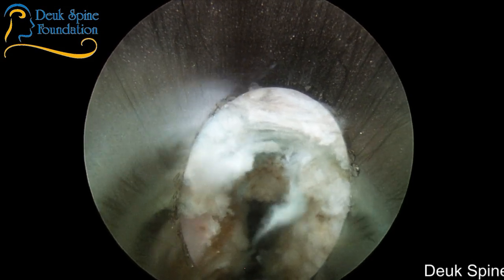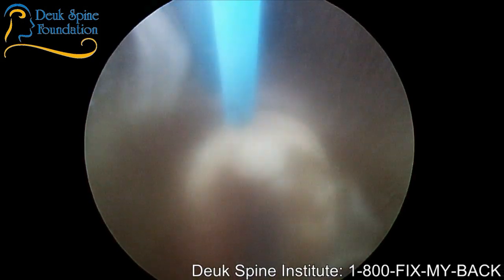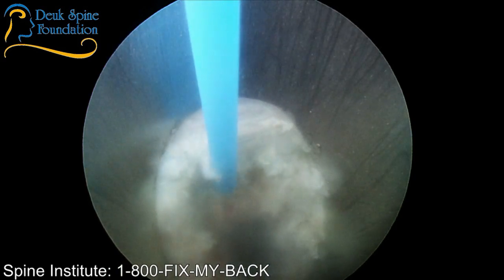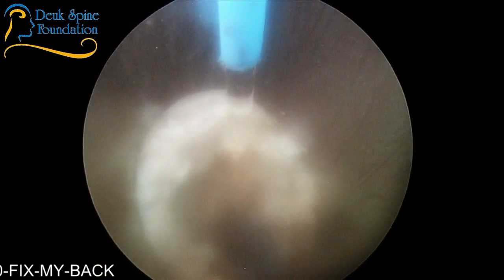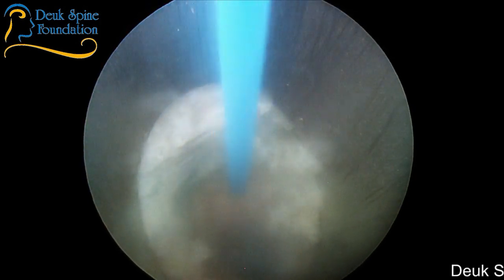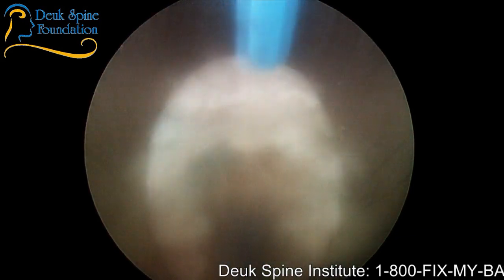All right, so pretty happy here. We've gotten 90% of this herniation out at 3-4. How's he doing? Good. And what you can see at 12 o'clock is really, if I pull back the tube any further, you're going to see the fat in the foramen and epidural space. You might see some veins that are in the epidural space. But this is all calcified concrete, herniated disc, bone spurs, and I've removed it all with a laser. And all we have left is just a little bit of the disc material. And then you have the posterior longitudinal ligament right there at 12 o'clock. You can see the white fibers right there running from left to right.